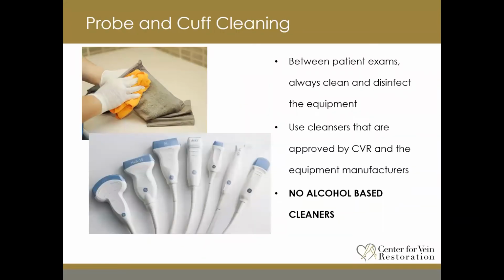The cuffs and the probes that we use, it's important that we properly clean them. I think this is very common sense. After each exam, it's necessary to clean and disinfect the equipment. There are certain cleaning agents that have to be used with the probe. There are alcohol-based cleaners that will strip the membrane off of the probe if used too frequently. So we try to avoid those and stick to the recommended cleaning products.